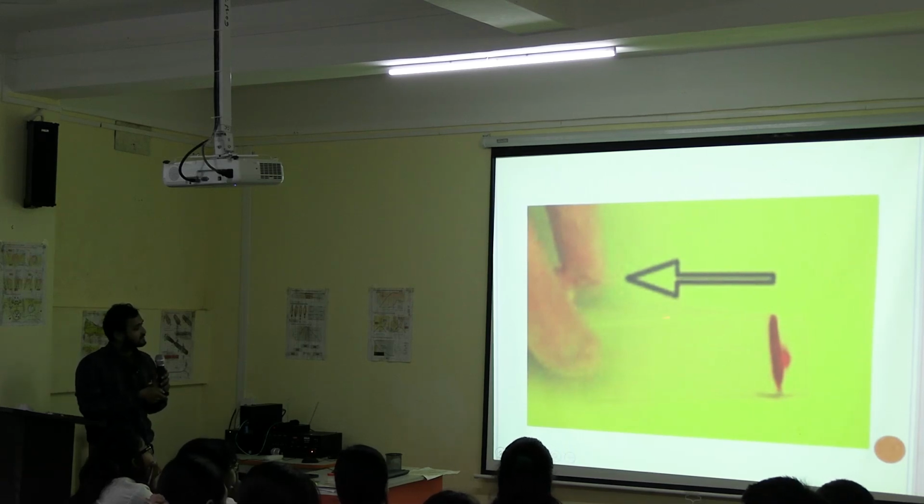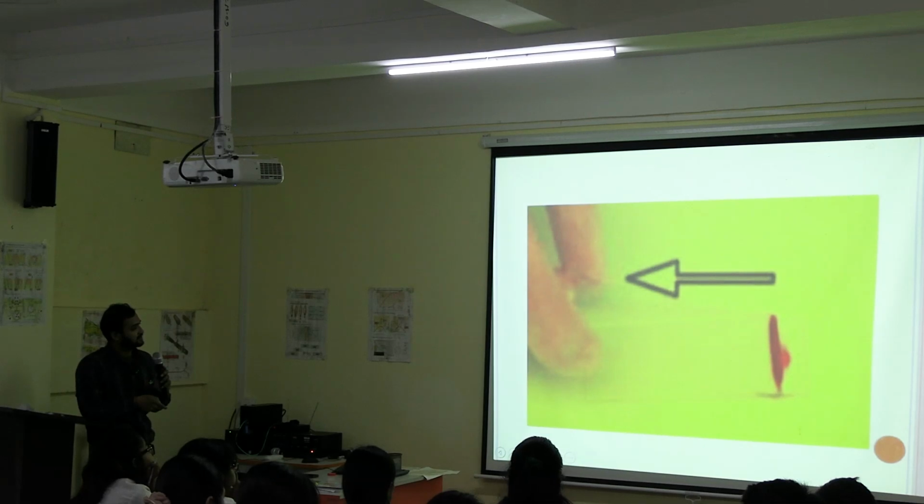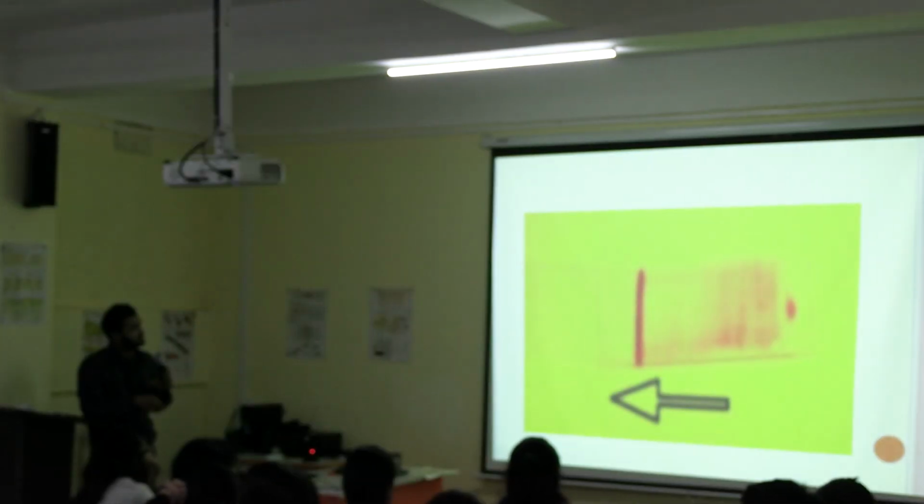There must also be some distance along the length, or the horizontal part. The spreader shouldn't go totally to the edge; at least this much distance should be there on both sides. You have to wait here, then the blood will be uniformly distributed with the help of capillary action, and then you have to draw it back. From here we bring the spreader, wait a few seconds until the blood has spread by capillary action, and then draw it backwards, or downwards, like this.